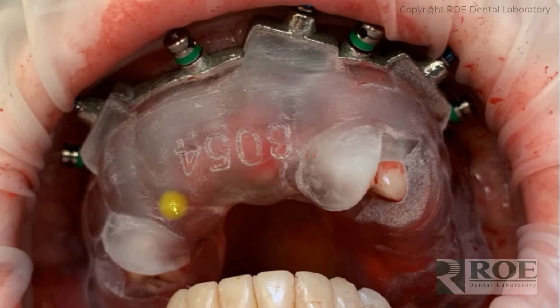If for some reason there's some rock to it, then it can be equilibrated like a denture. A little indicator, figure out where the holdup is and adjust it. If it's rocking a lot, then you want to stop, and we need to evaluate. That is really rare. These pin guides will fit. The casts have been vetted by you and by us.